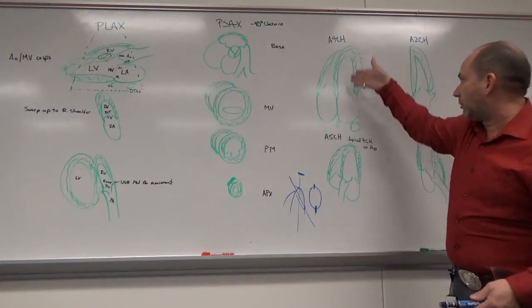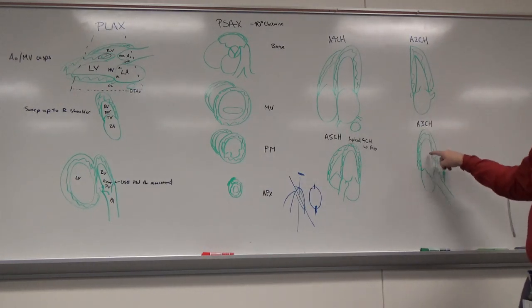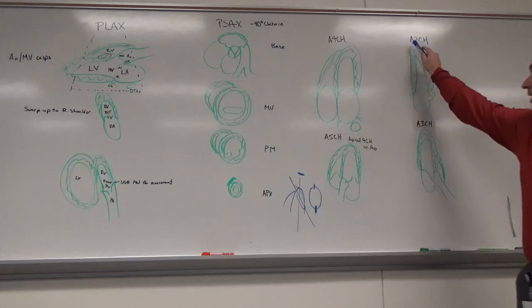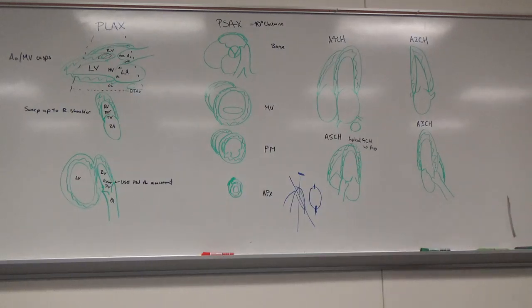So if you can line this up perfectly here, when I spin it, I should have almost a perfect 2D view, or a 2-chamber view here, and then I spin it again, I should have almost a perfect long axis view. But I need to be exactly over the apex, and I need to be swept so that I'm exactly in the middle of the chamber. If I'm not, that's where you're going to struggle, okay, which kills time.